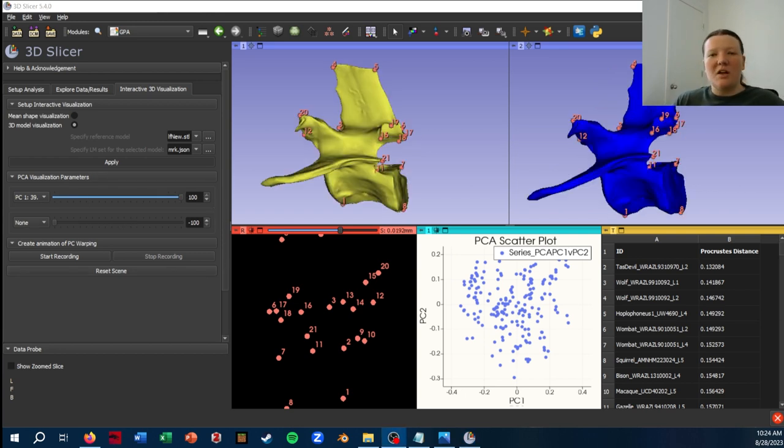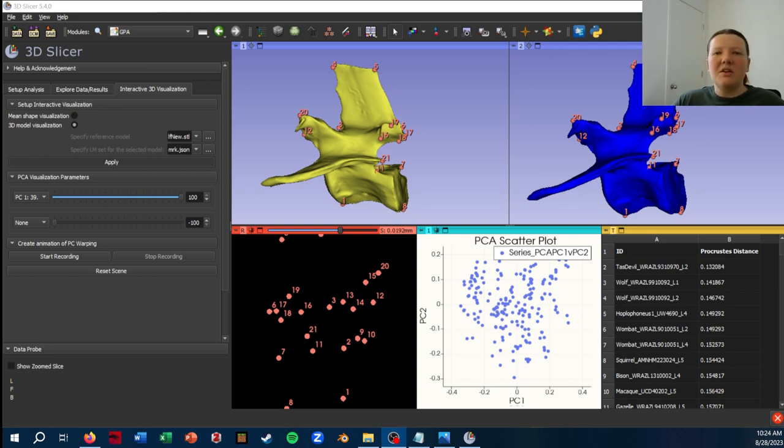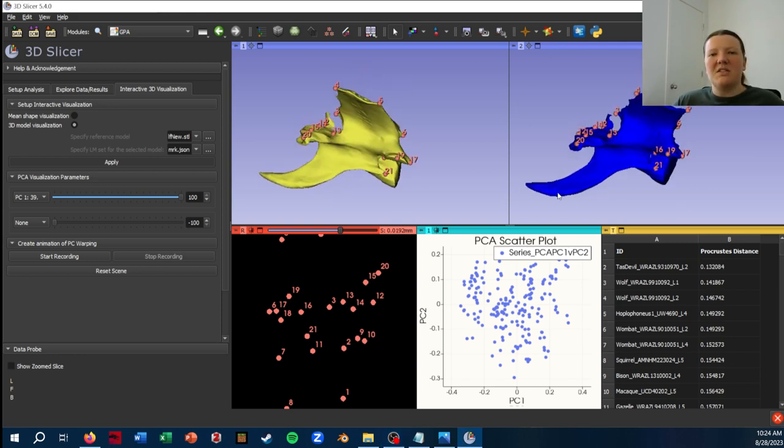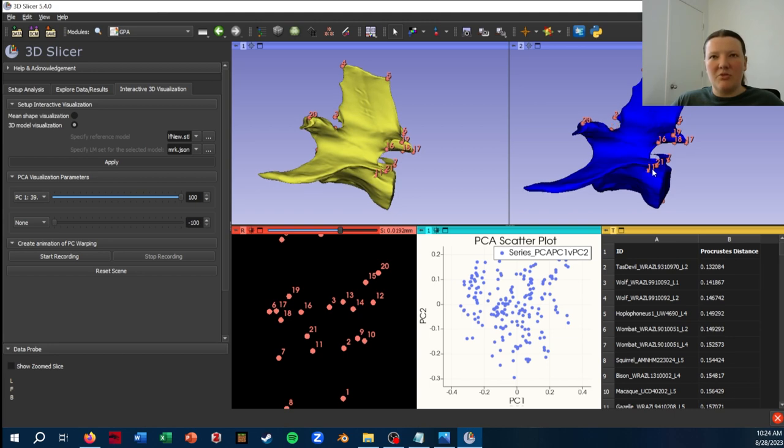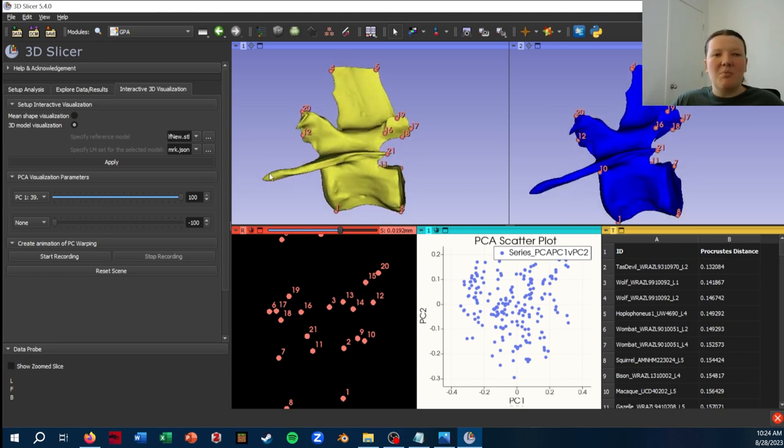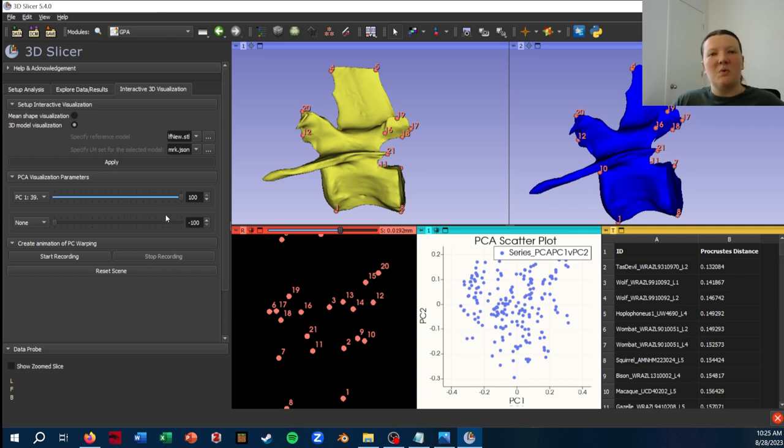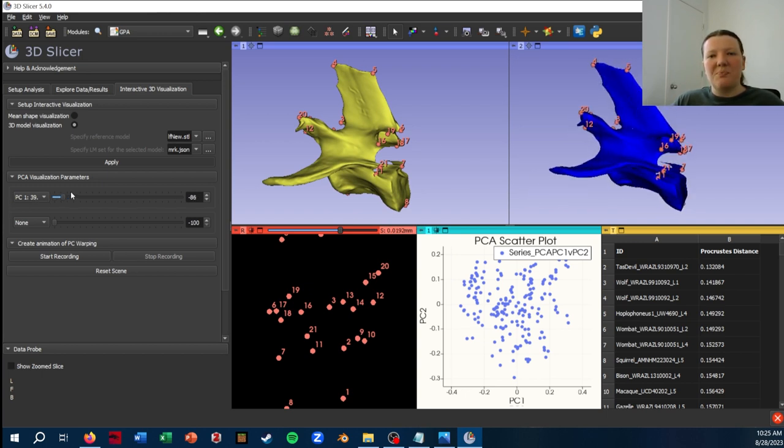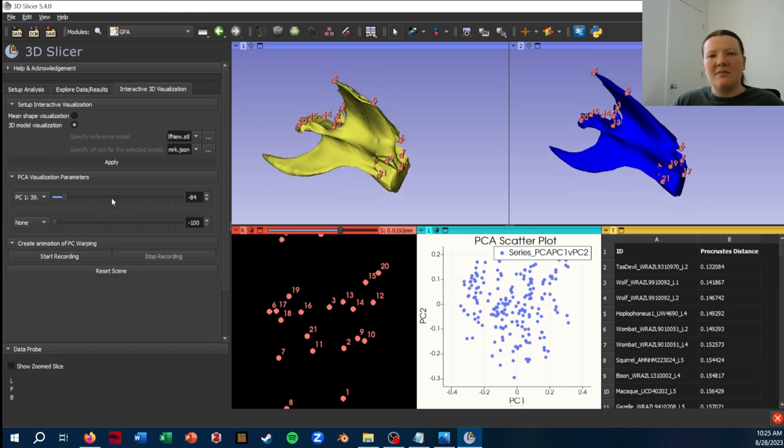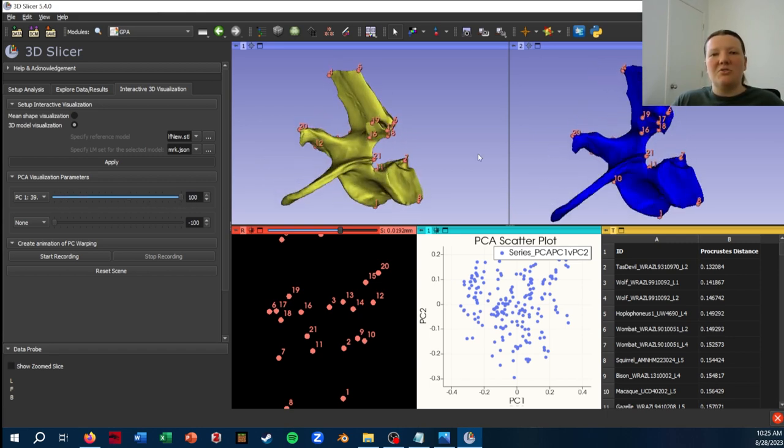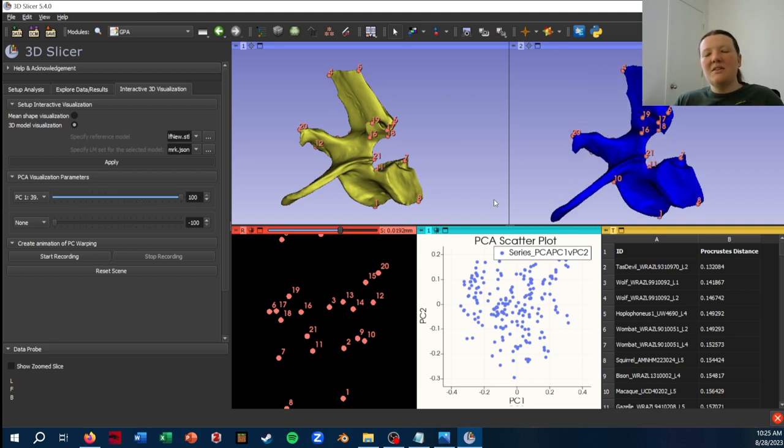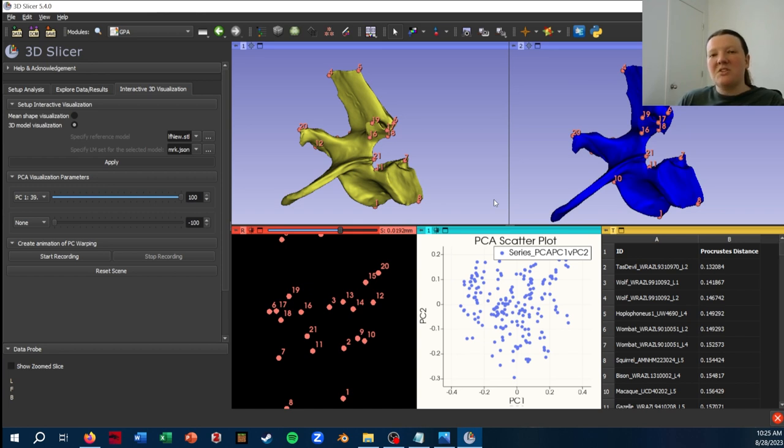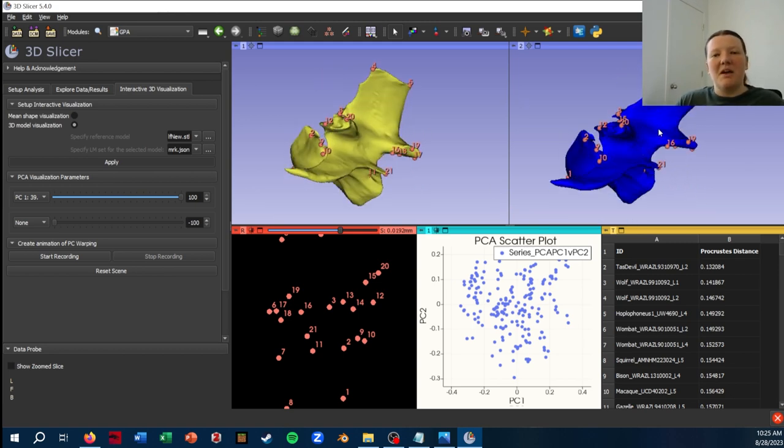And one other caveat to be aware of is that you can really only trust the warping where you have landmarks. So to give you a really concrete example, you might notice that I have no landmarks on the transverse process of the vertebrae here. That's because it's broken off in like three quarters of my specimens. But because it's still part of the mesh, the transform that's being applied to warp the beaver vertebrae to these coordinates is still going to warp that transverse process. So you'll see it get really skinny, really long. It'll change its angle. And because I have no data on what the actual shape changes of that are in my data set, I don't want to make any interpretations from those changes in the mesh.